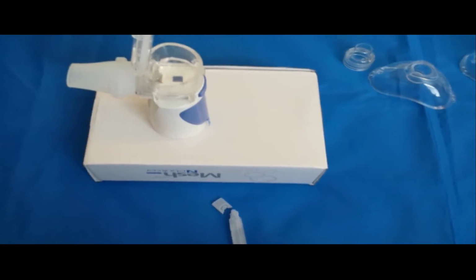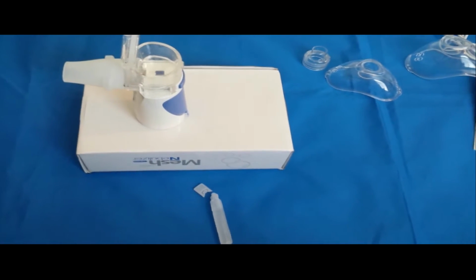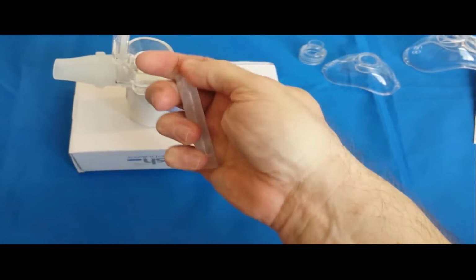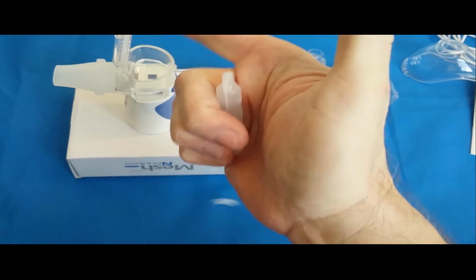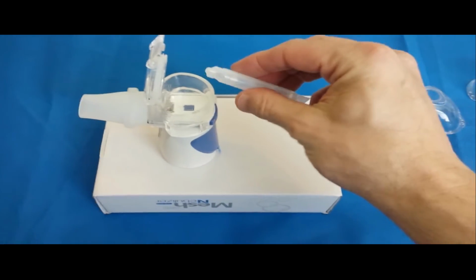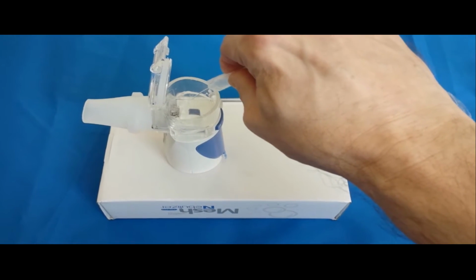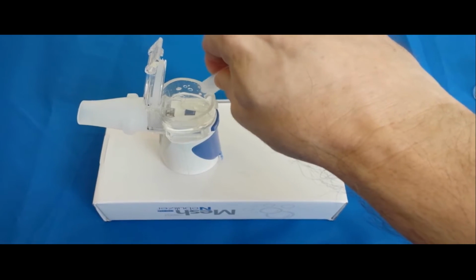Alright, I'm going to try to show you how to put the nebulizer fluid in the machine. You get one of these little tubes. You twist this top piece off. That comes off. Usually you have to use two hands, of course. Once you have that off, you tip it in here. A couple squirts till it's all empty.